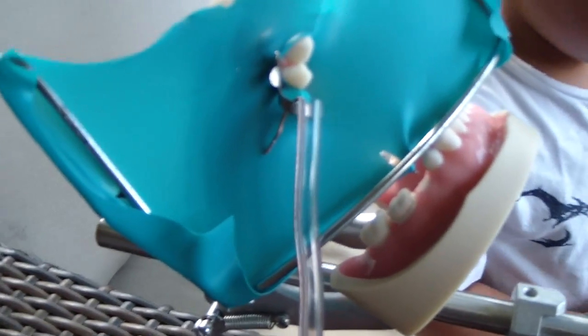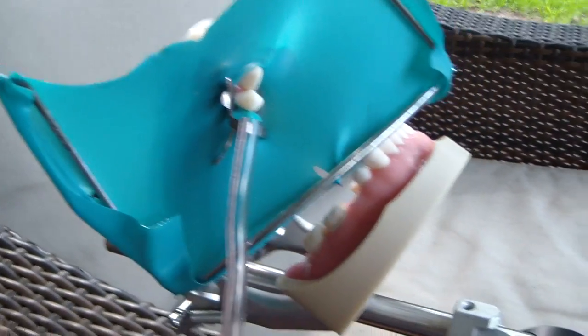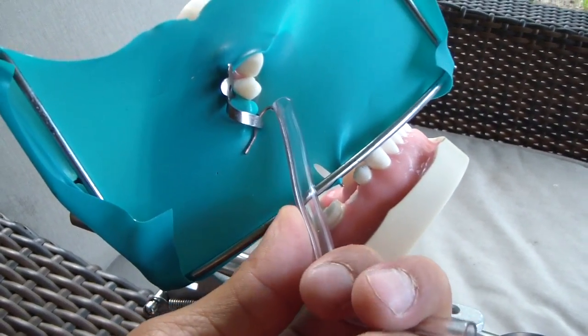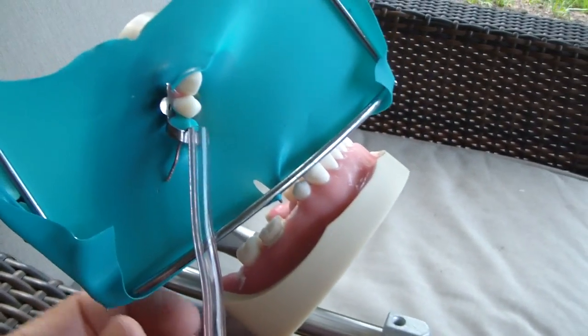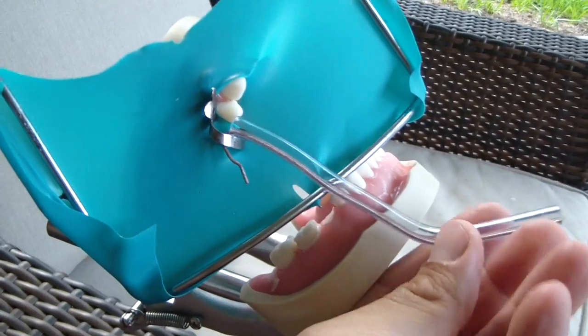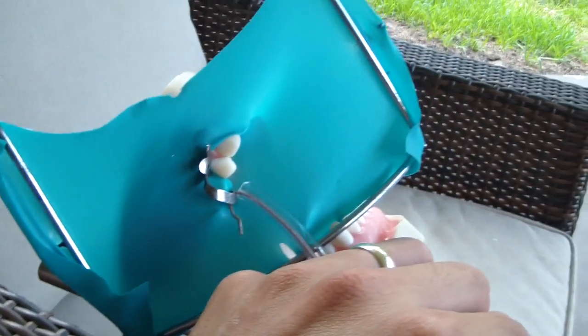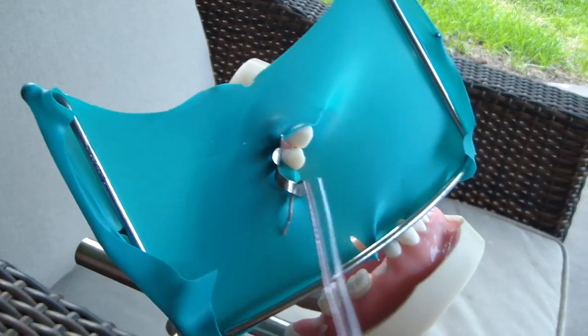So what you can do now, if you don't have a dental assistant and you still need some suction, you can use this and form it the way you want it. Hopefully that helps — I've used that a number of times. You can get the patient to hold it across their chest if need be. So there's your dental assistant in your pocket. Cheers.